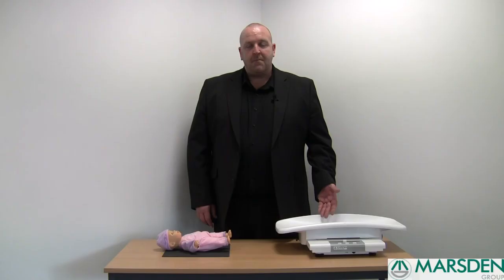Once again, this is our lightweight portable baby scale, available in an MS4100 model with a 20kg capacity and an MS4101 model with a 50kg capacity. Ideally suitable for maternity wards and community midwives.